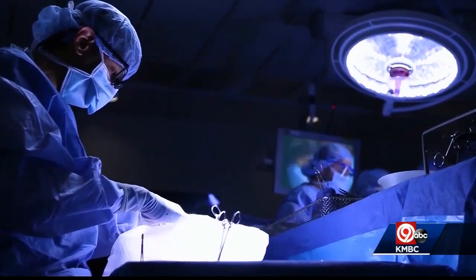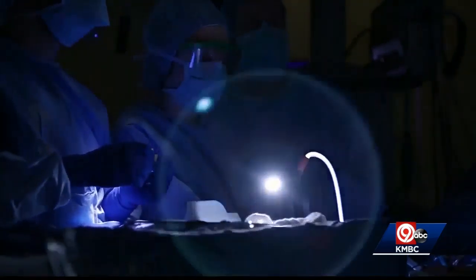It provides the breast surgeons and providers a more accurate and precise way to localize and remove the cancerous tissue. Dr. Bettina Lowe says that means less tissue is taken, improving recovery.